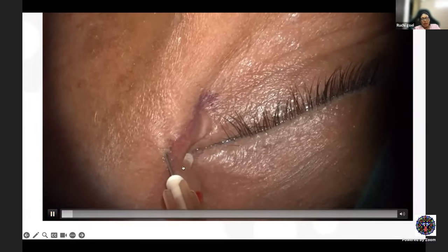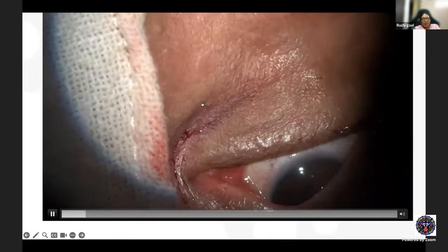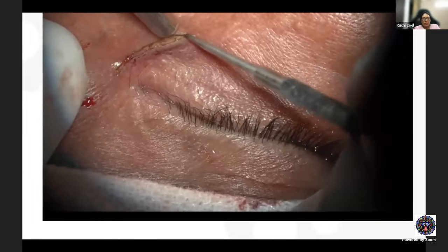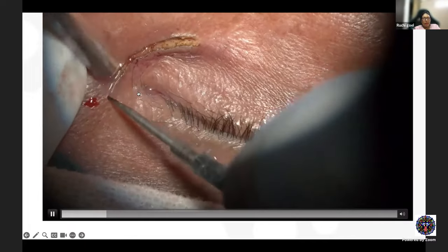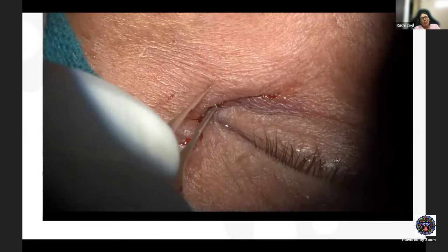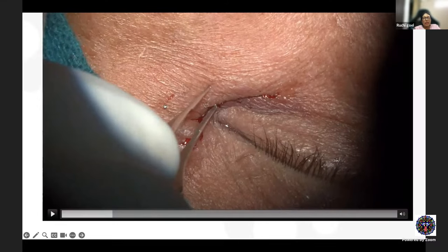This is the infratrochlear block, followed by the infraorbital block. The superior punctum is dilated with a punctum dilator. For the skin incision — placed near the anterior lacrimal crest — you can incise either 3 mm from the medial canthal ligament or about 10–11 mm from the medial canthal area, as the angular vein runs approximately 8 mm from the medial canthus. Incision length in external DCR varies from 10 to 15 mm.